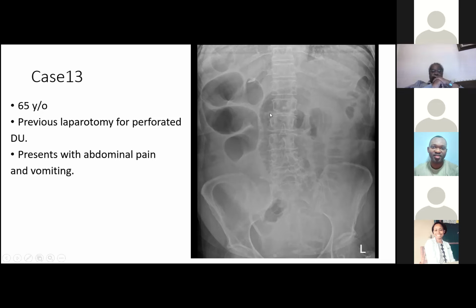Essentially, it's not as prominent as the other one, but going towards the left side, there's probably some coin stacking there as well. Maybe not as prominent. And obviously the rectum is empty. I can't typically see the outline of the large bowel, so I guess it's mostly collapsed. So I would think this is probably small bowel obstruction.